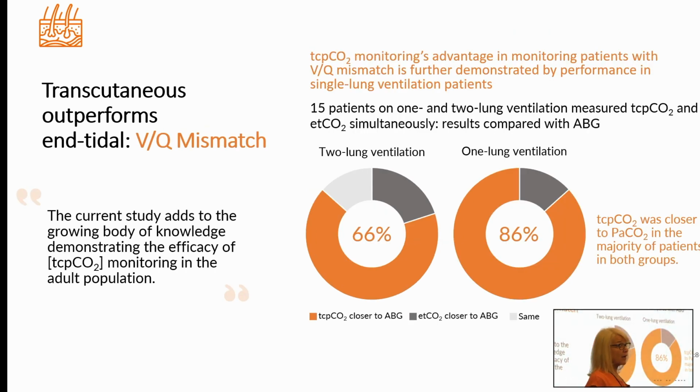Now, I talked about how transcutaneous monitoring avoids the issues of ventilation perfusion mismatch, and this study really highlights that. This study took a look at patients who are on 1 lung and 2 lung ventilation. If you're not familiar with 1 lung ventilation, it's a forced scenario of ventilation perfusion mismatch where for some reason we're only ventilating 1 lung. Typically you're not going to see that in the sleep lab. Where you're going to see that is in surgery type of patients or patients who've had a lobectomy.